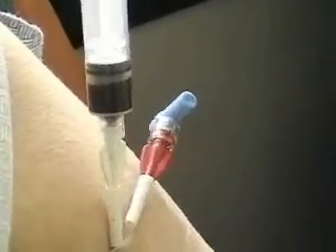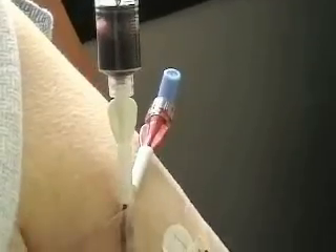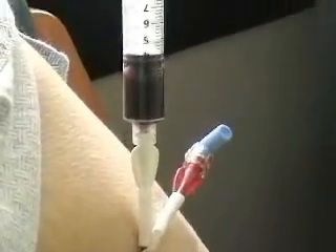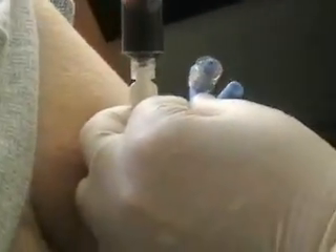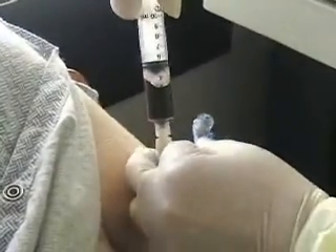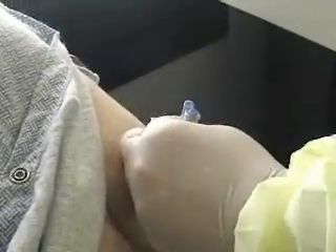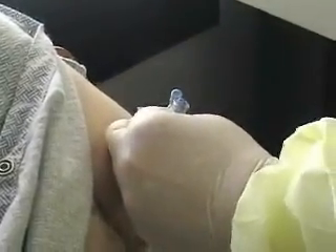The lab already sent you the tube? Yes. I have the tube from the lab and I've labeled it. That's very important, students — always label your tubes going to the blood or down to hematology. Transfer that in and then flush.